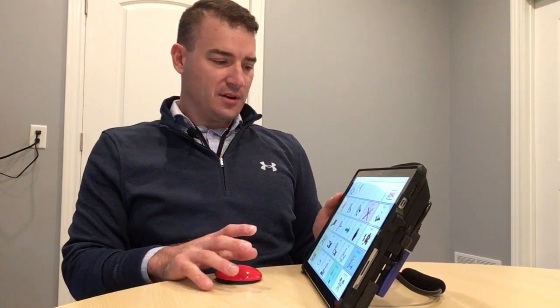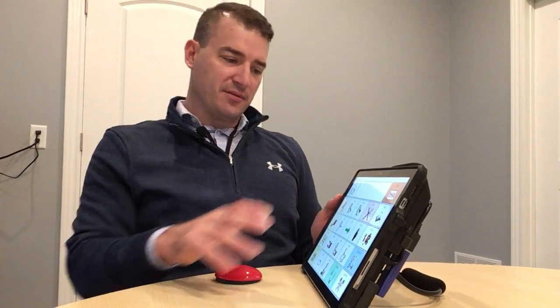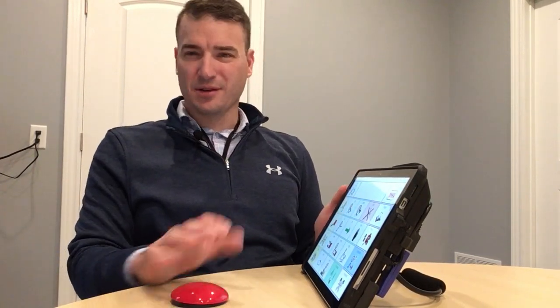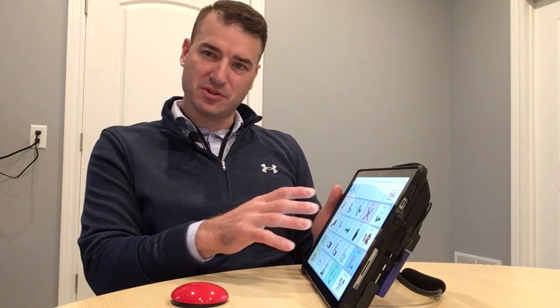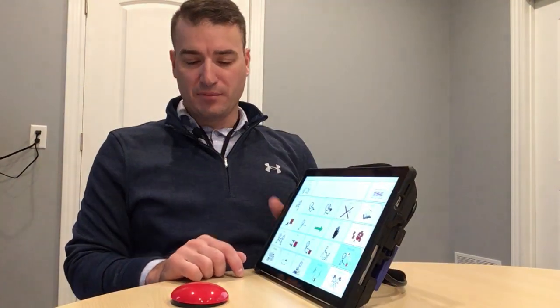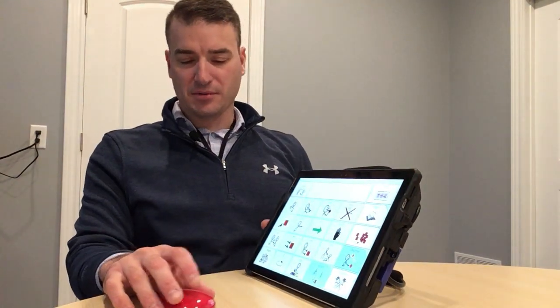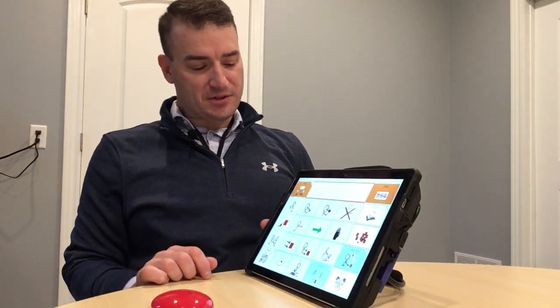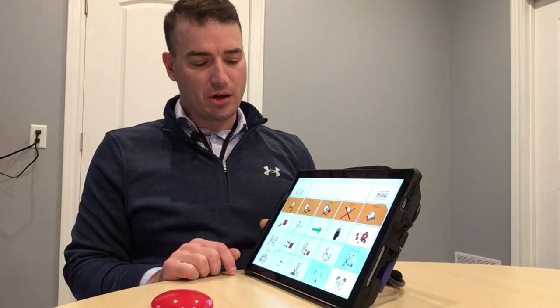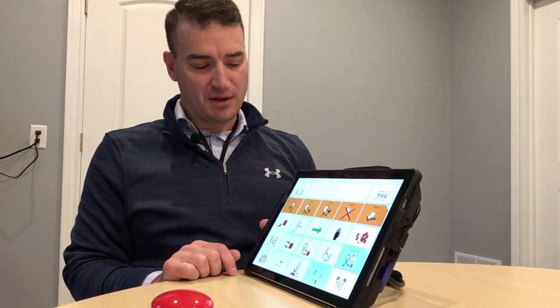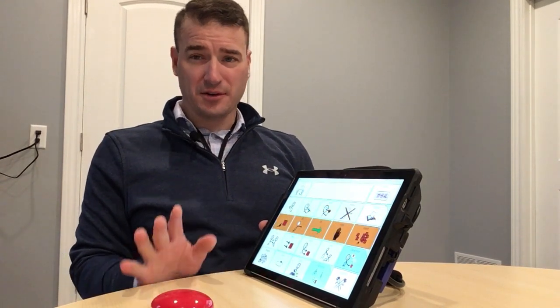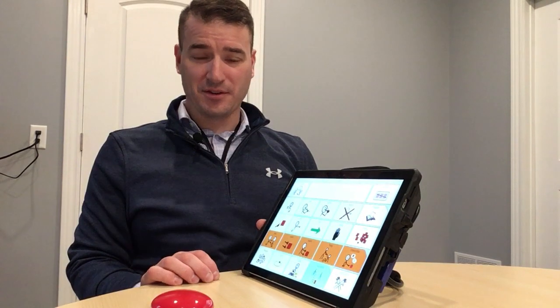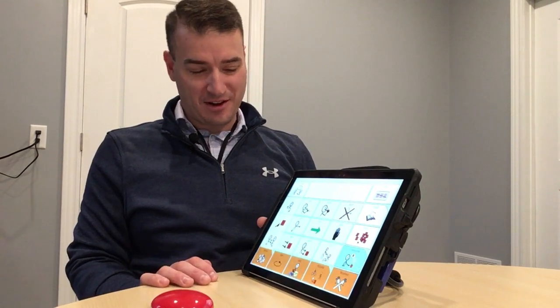So this is switch access, and if you're not familiar — people that can use a switch, this is called indirect selection, because you're not directly making the selection you want, but when you press the switch, the software goes into row column scanning. There's a lot you can do with switches.